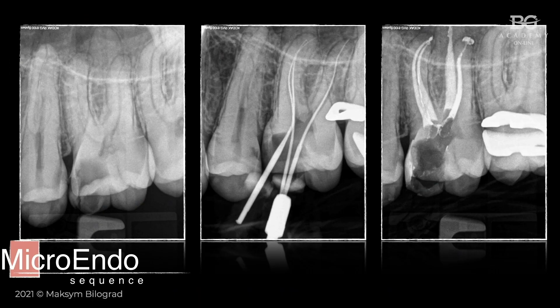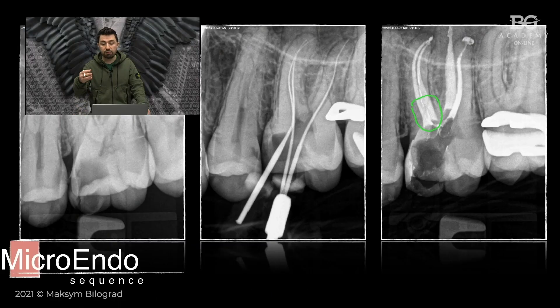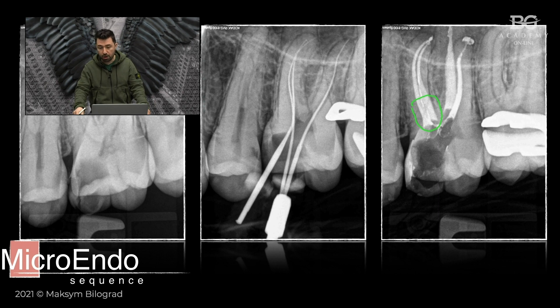Here you can see what I am trying to explain — the root canals in the coronal part are over-instrumented. This is not a good feature, because if the walls of the roots become very thin, you may get strip perforation or the root may become very weak, and after a while you may get a vertical root fracture. So over-instrumentation, especially on the coronal aspect, is not a good option and we have to try to avoid it.